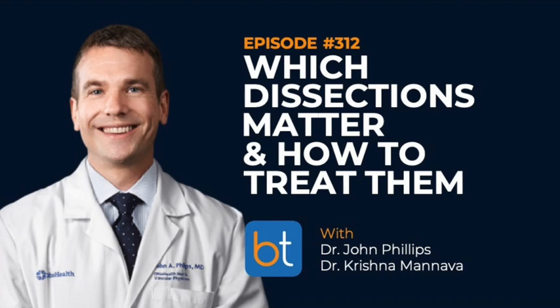We have the Phillips IVUS, and my understanding is that Boston's might be a little bit easier to see. But a couple of things I've noticed, to your point, is that when you get into the smaller areas of the vessel, the device can almost fill up the whole lumen, so it's hard to see dissections. I don't really use IVUS for dissection assessment, to be honest with you. I'll use it just to help size and take a look.